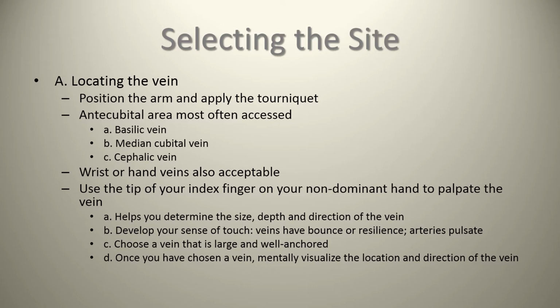Once you have chosen a vein, mentally visualize the location and direction of the vein. I'm going to mention it again. An old nurse once said to me, "Go for the vessel that you can feel, not for the one that you can see."